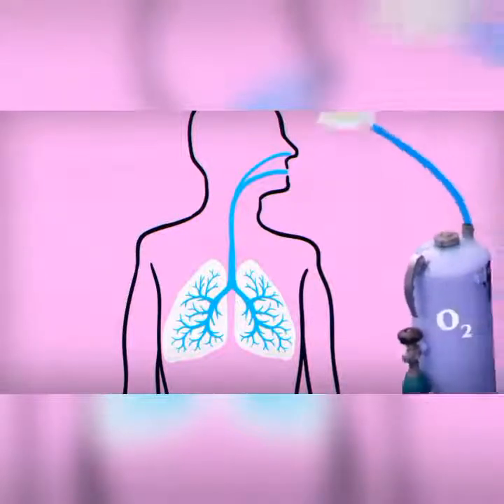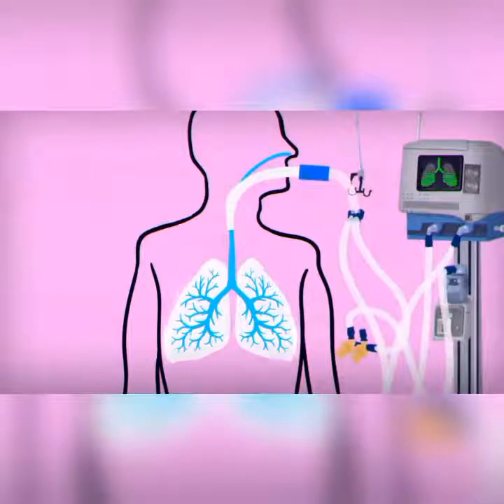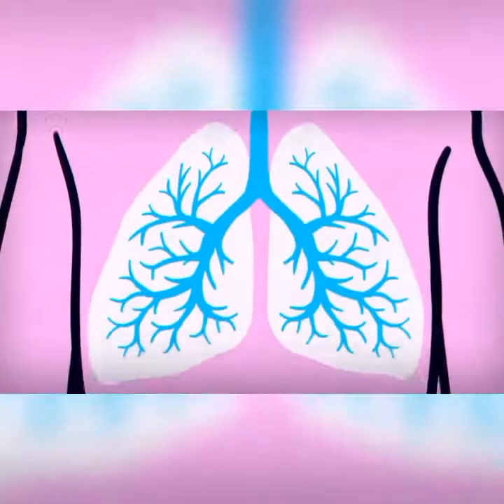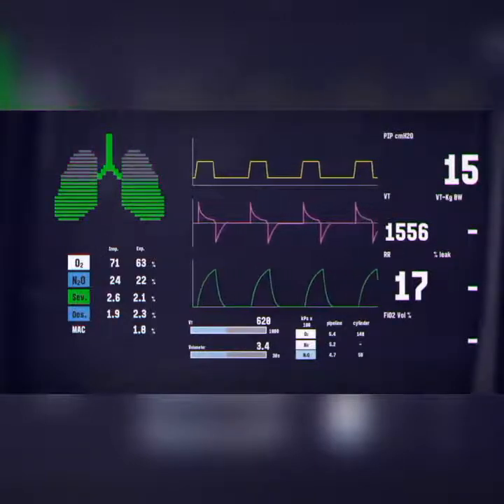For milder cases, this can be done non-invasively. Often, a face mask is fitted over the mouth and nose and filled with pressurized air, which moves into the patient's airway. But more severe circumstances require a device that takes over the entire breathing process. A tube is inserted into the patient's trachea to pump air directly into the lungs, with a series of valves and branching pipes forming a circuit for inhalation and exhalation. In most modern ventilators, an embedded computer system allows for monitoring the patient's breathing and adjusting the airflow.